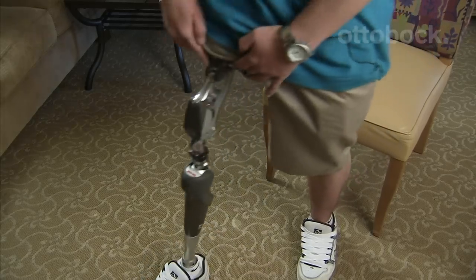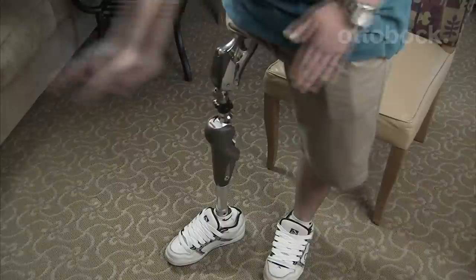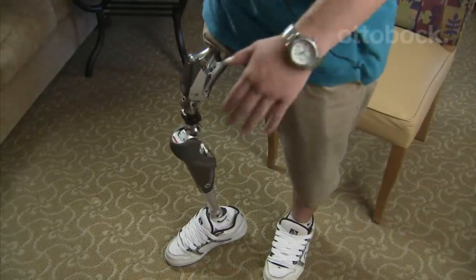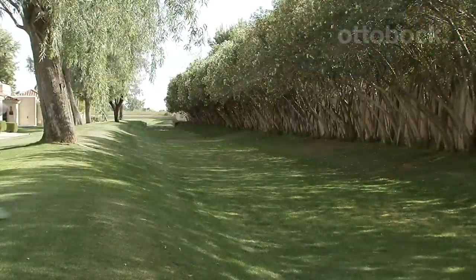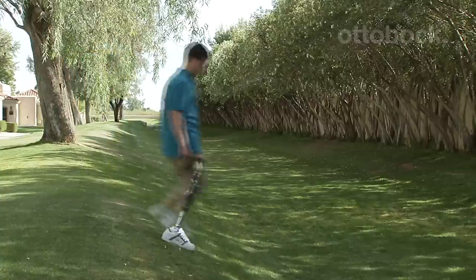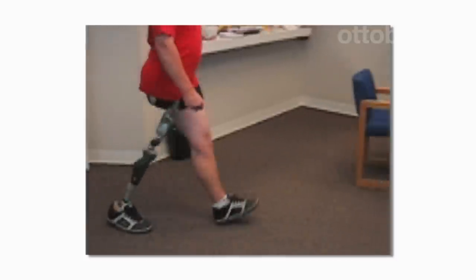Every step, when you strike your heel, it'll absorb some of that motion. When you're in mid stance, the elastic bands will stretch, and then when you're ready to step, it'll help you start that step. The hydraulic also makes it easier to balance on the hip joint. For you, this translates into equal step lengths, rather than compensating for the limitations of your prosthesis. That makes every step more stable.